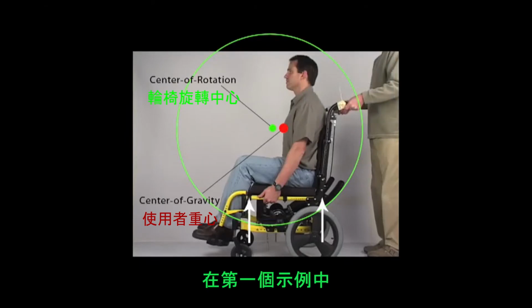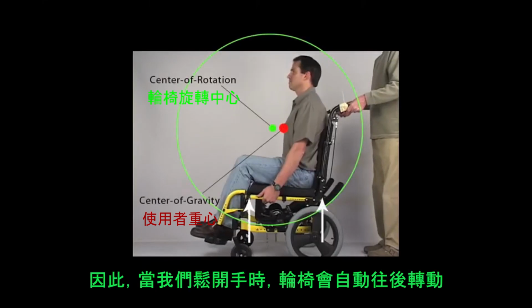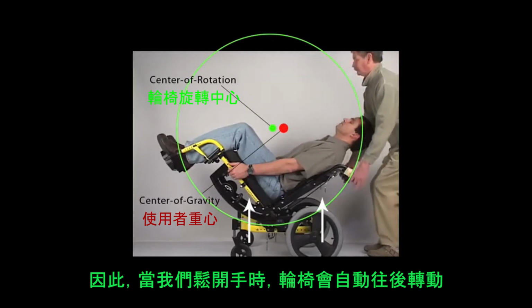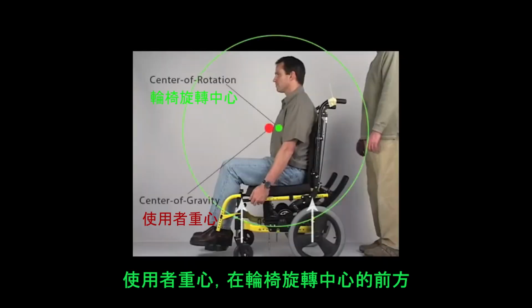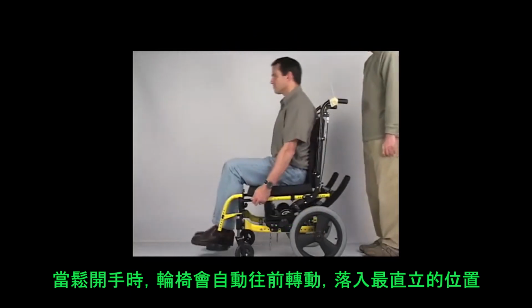In the first example, the center of gravity is behind the center of rotation. As a result, when support is left on the chair, it falls automatically into the most tilted or rotated position. In the next example, center of gravity will be in front of center of rotation. In this example, the chair will fall into the most upright position.